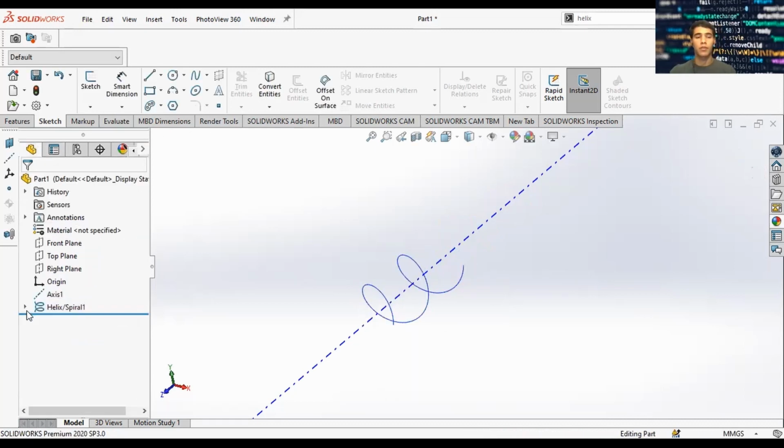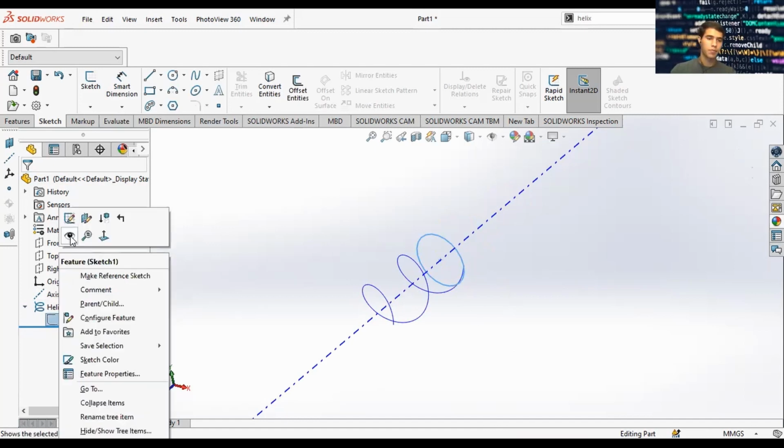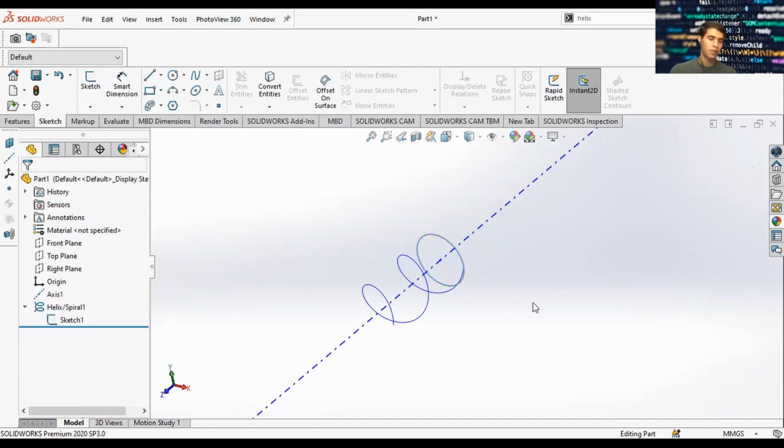Now you see the sketch for the circle disappears. See how it disappeared? We're going to go ahead and bring that back. Whenever you have a feature you want to bring back on the family tree, you click show. This should bring that feature back. And there it is. We have our helical spiral, and right now it's just a line. It's not a solid body.